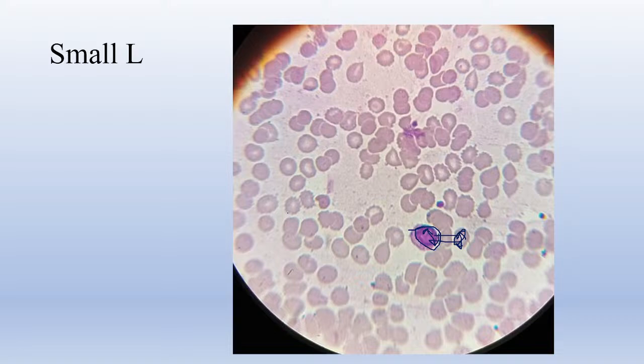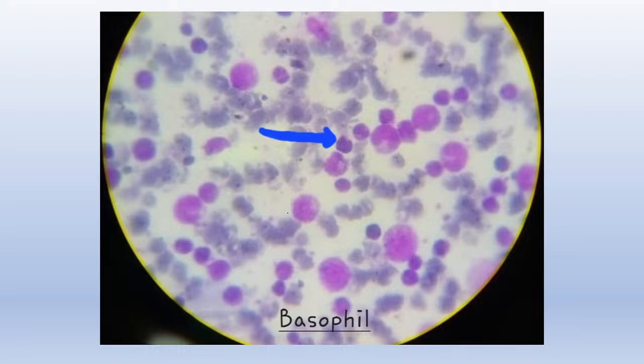So now next we shall be talking about basophil. Basophils are less than 1% of the WBCs. The nucleus is U or S shaped, with indentations, and there are large dark purple cytoplasmic granules. It helps in the immediate inflammatory response. It releases histamine and other molecules during allergic responses and parasitic infections. It is basically the least reported cell. Mostly when doing DLC, we don't even find basophils. But over here we have seen a basophil. This is how the basophil looks. And next, this is all.